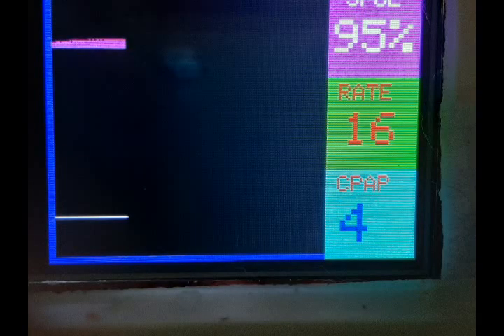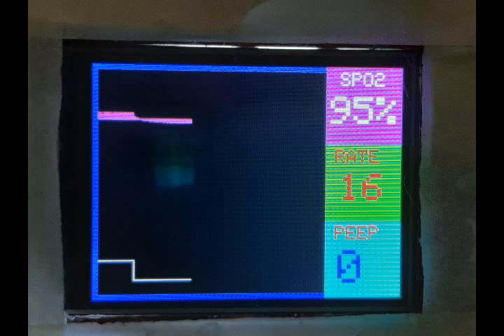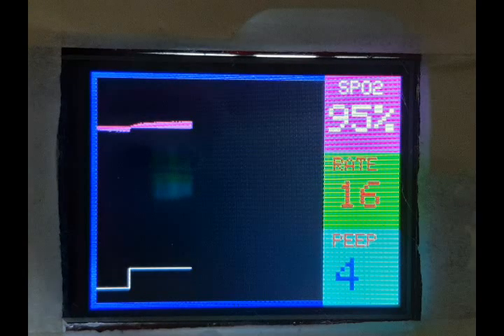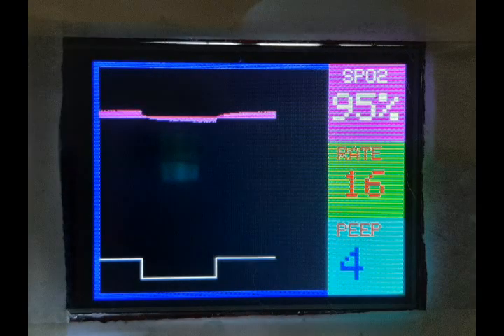Actually CPAP is continuous positive airway pressure, which means the pressure is a continuous flow by the blower. So there is no end pressure, no peak and no varying level of pressure. It will continue at one level of pressure, either a minimum or maximum pressure level. And PEEP means positive end expiratory pressure. So this means there is an end pressure and there is a peak level pressure. The pressure will come to 0 and again go to the peak level, which is your set level of the pressure. This is the difference between CPAP and PEEP.